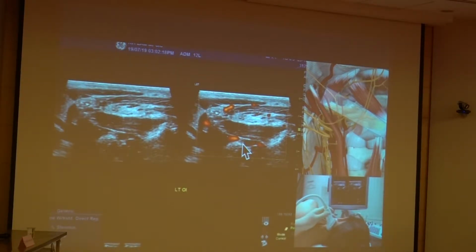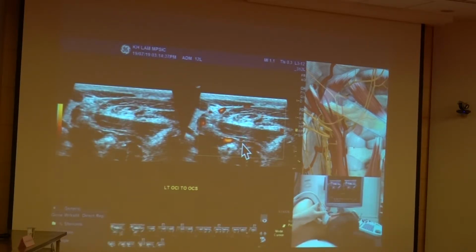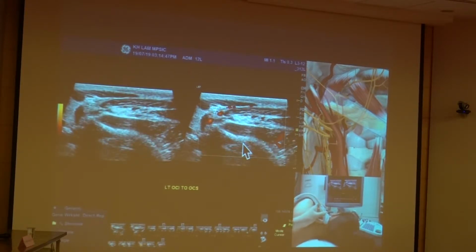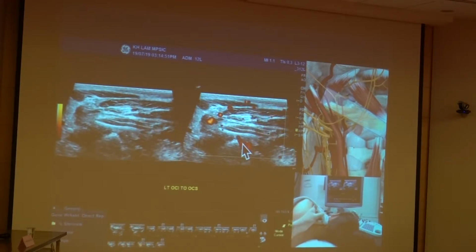Pivot the medial end of it upward. You're leaving the C2 spinous process very soon. When you're leaving the C2 spinous process on the medial side, there's another thing I want to remind you of: on the medial edge of your obliquus capitis inferior, you also have a dural bridge.